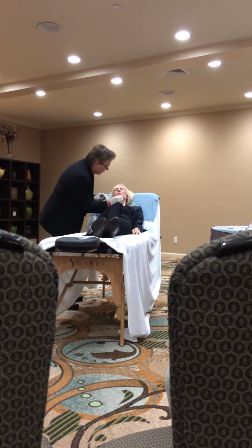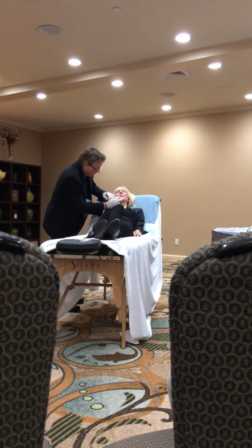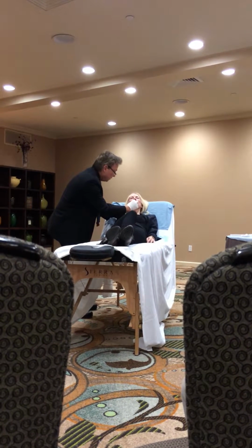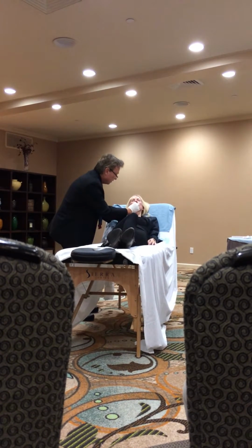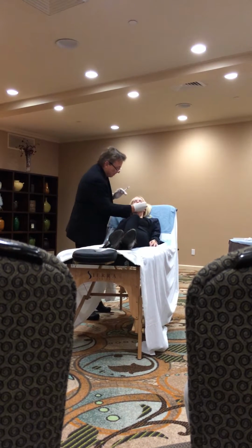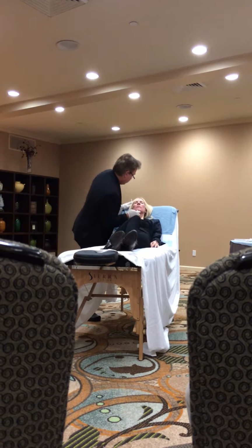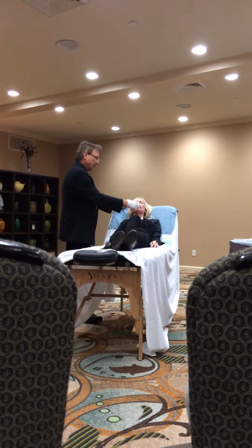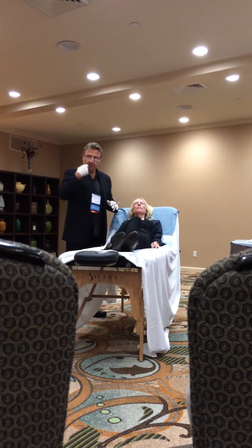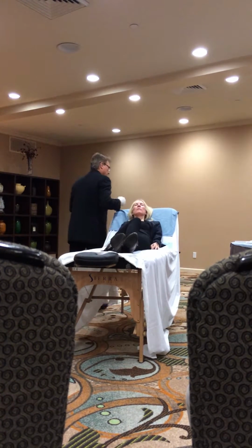Okay, I'm going to come over here because I went over here and I did this thing over here. I'm going to go in here because this is an area she pointed out to me. I'm just about done, and then between patients, I'll answer questions. I do a lot of putting product in as I pull back. I have a little bit left. I see this cheek is up a little bit higher anyway than this one over here, and this gives me an opportunity. I have like 0.2 left. I'll come from this side.